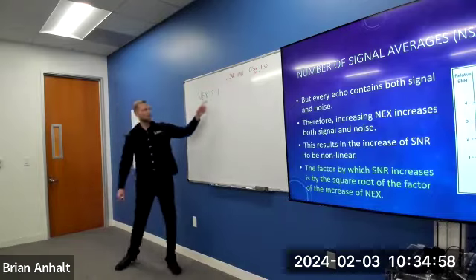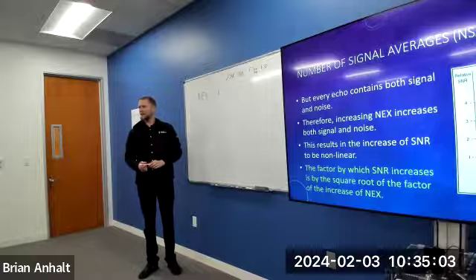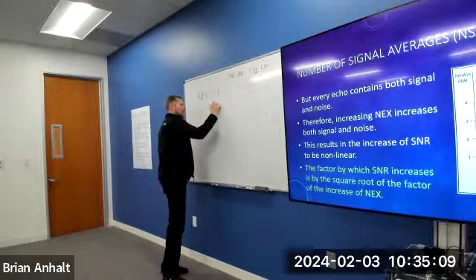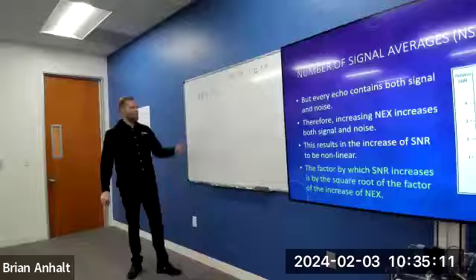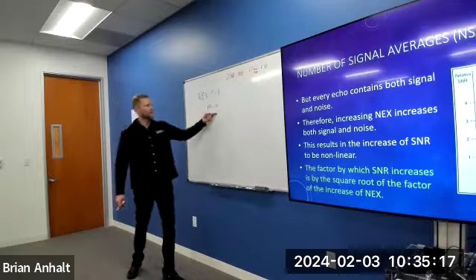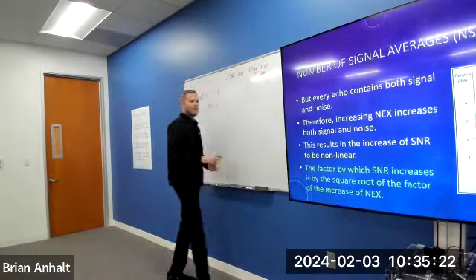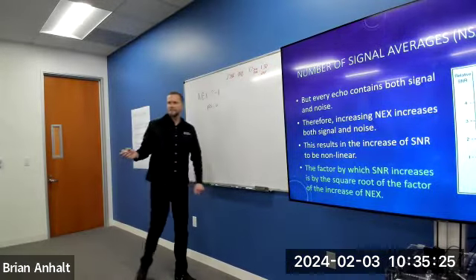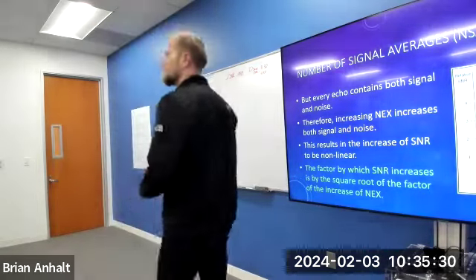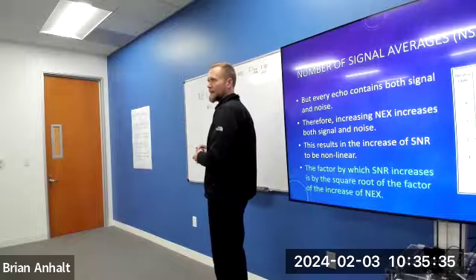So what's the factor of increase here? What times 2 equals 8? 4, right? It's not 6. We're not adding, we're multiplying, right? So my factor of increase equals 4. So I can figure out right now how much more scan time I have. Right? Take that 4 and multiply it by what? Right? So 1.5 times 4 is 6. 1 minute and 30 seconds, that's 1.5 minutes times 4.